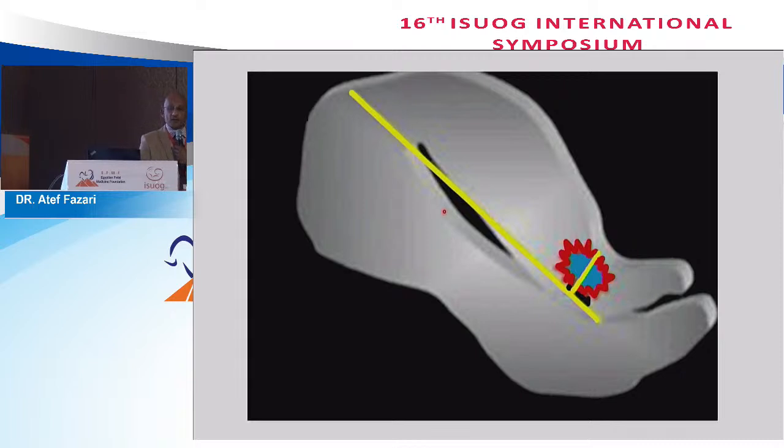But here we have the same line, and down is the perpendicular line. The whole sac, or at least 2/3 of it, occupies or covers the triangular defect site. This is clearly crossover sign type 1, and this is a scar pregnancy, no doubt.